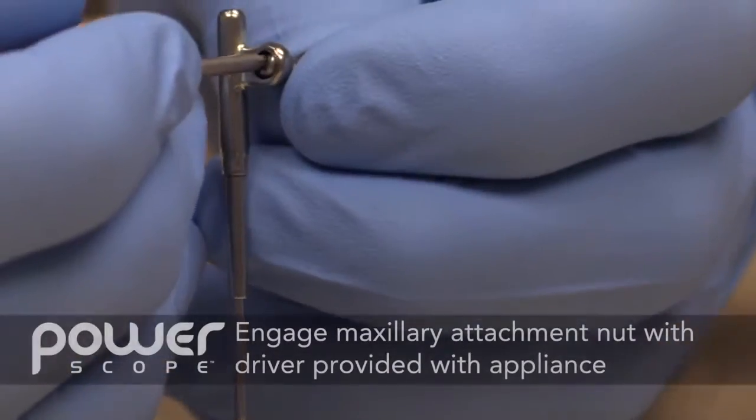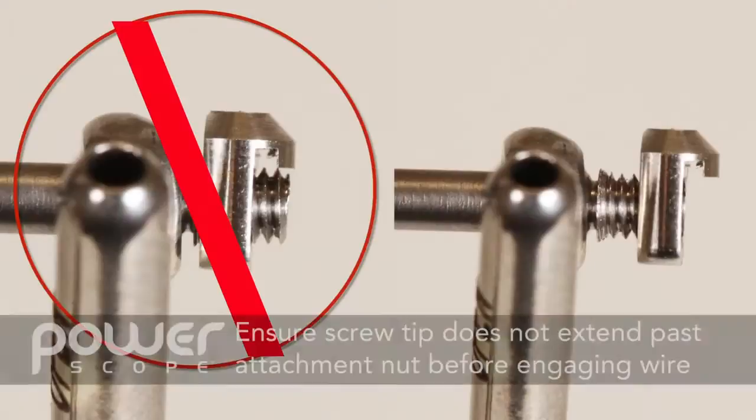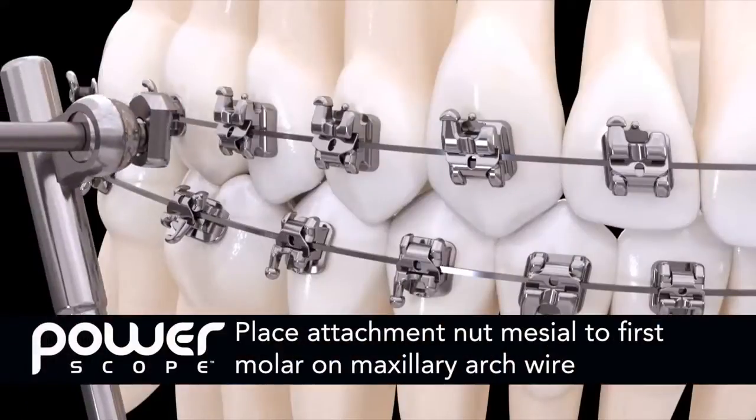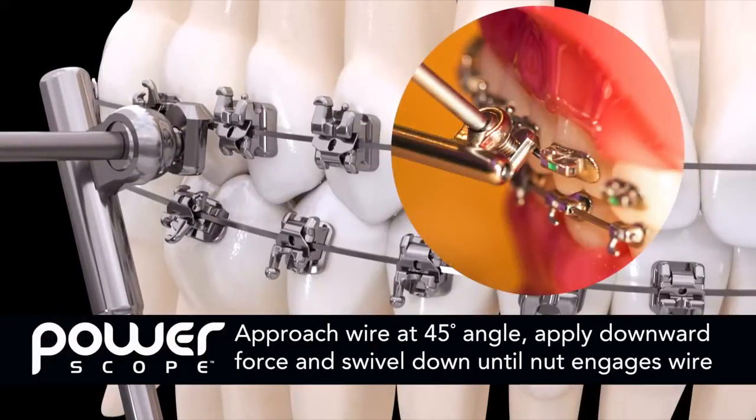To install, first engage the maxillary attachment nut using the wrench provided with the appliance. Please ensure the screw tip does not extend past the attachment nut before engaging the wire. Place the attachment nut mesial to the first molar on the maxillary arch wire. Approach the wire at a 45 degree angle, apply downward force, and swivel down until the attachment nut engages the wire.